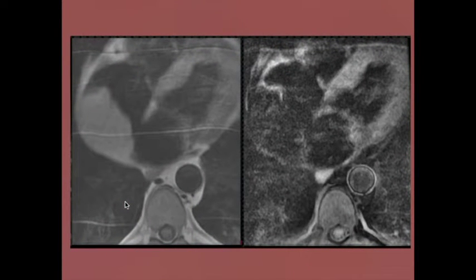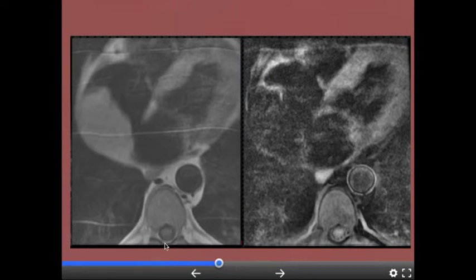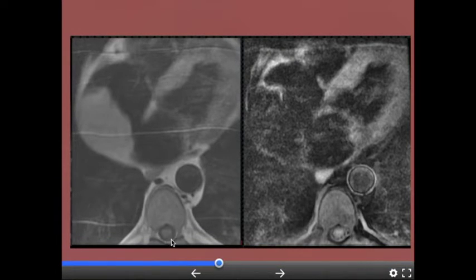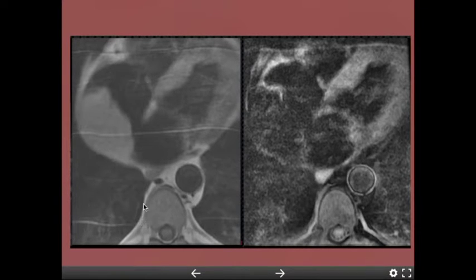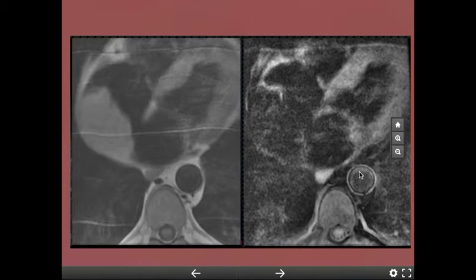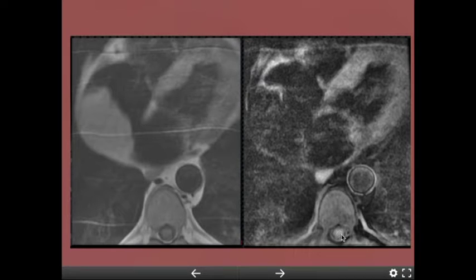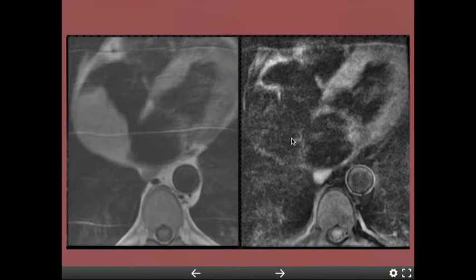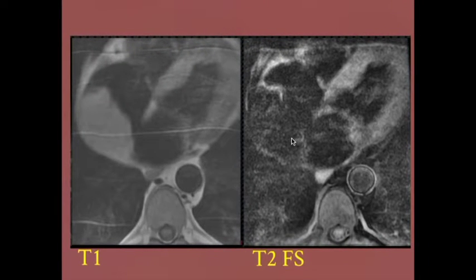Here's a case: T1 without fat saturation — epidural fat is bright, CSF is dark, blood pool is black from double inversion recovery. We see a lesion in the posterior wall of the right atrium. The next sequence is T2 double inversion recovery with fat saturation — the CSF is bright, the spinal cord is bright (T2 feature), and the periaortic fat is now gone. This mass saturates with fat saturation, making it dark — this was a lipoma.